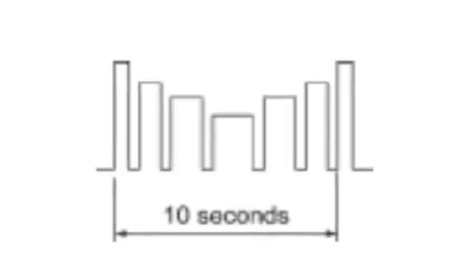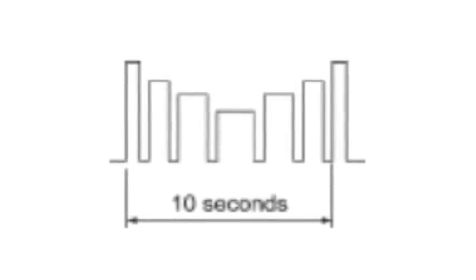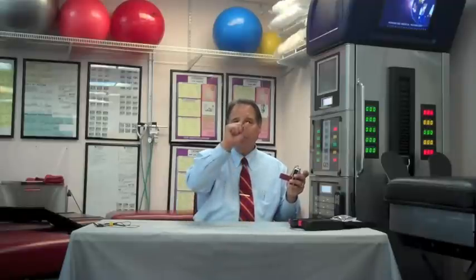In SD1 mode, basically what happens is the strength and the pulse width are varying throughout the treatment. It will go from high to low and back up to high. In the SD2, it does a similar pattern, but what happens is the strength will vary more from top to bottom. So it'll go like this.